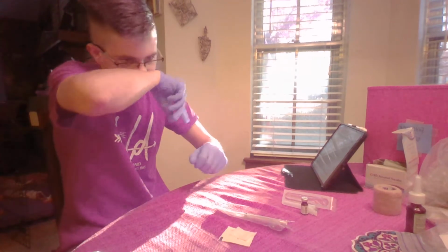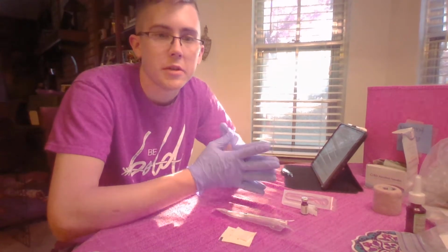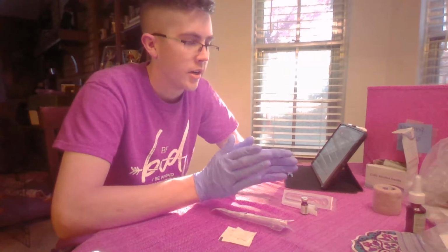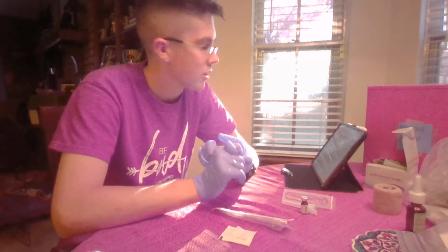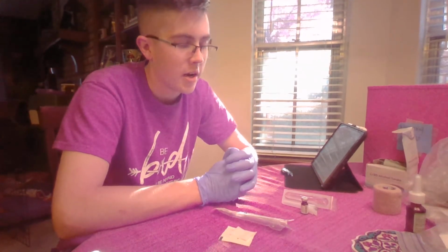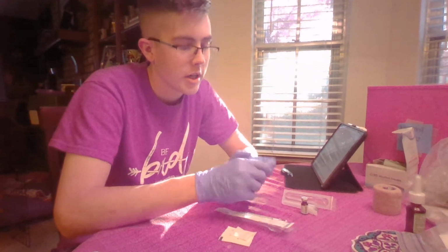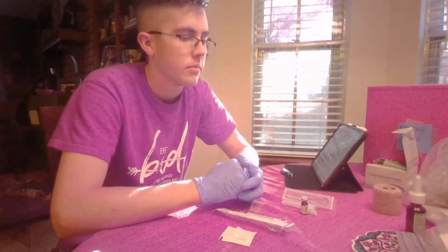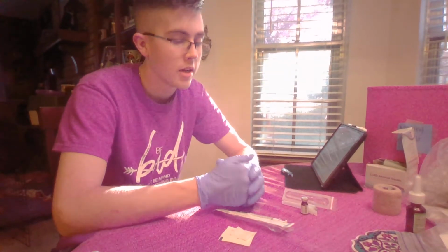Okay. Start off, gather all my materials, make sure that my patient is being ventilated adequately. Ask my patient if they have any known allergies. And then I will explain to my patient that I am going to be drawing up a medication, inserting it into their nostrils, and then asking them to eventually breathe it in.